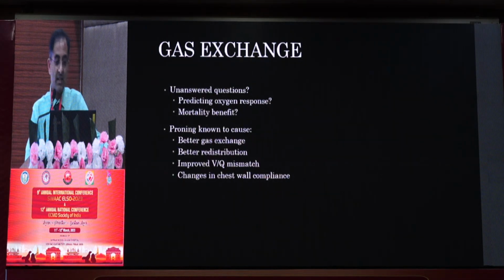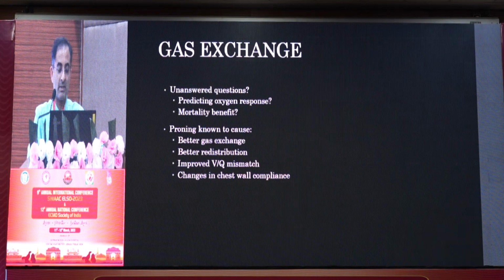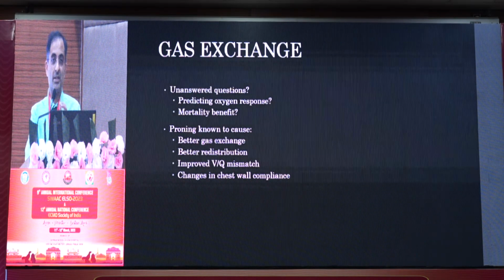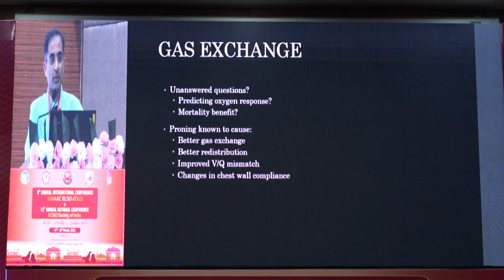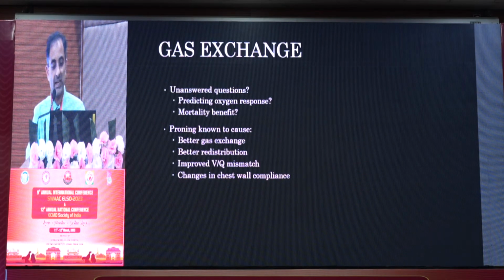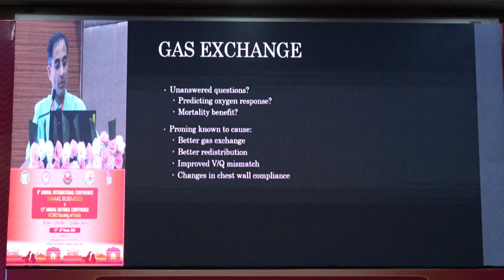Now, whether this translates into better outcomes is something we are still not clear about, though, as I will show you, there seem to be trends of that happening. Also, in a patient who is already on ECMO, predicting oxygen response, or predicting improvement in oxygen, is essential to determine whether a given patient will benefit from proning. Because we need to understand that proning a patient on ECMO is not as simple as proning somebody who is on mechanical ventilation. So that is something we have to see if we can ascertain before actually taking the entire trouble of proning a patient who is on VV ECMO.